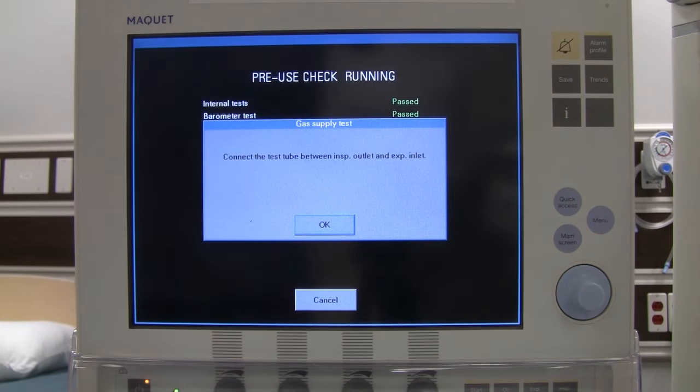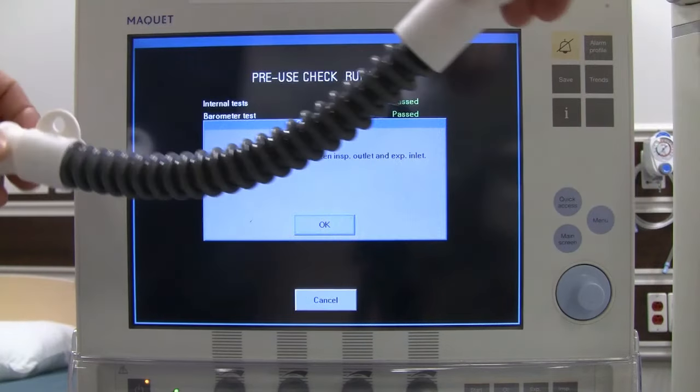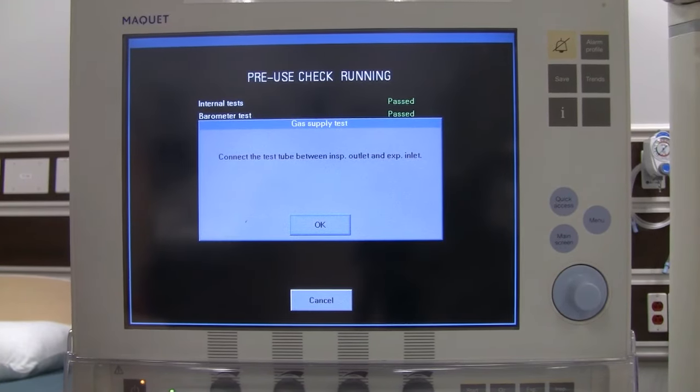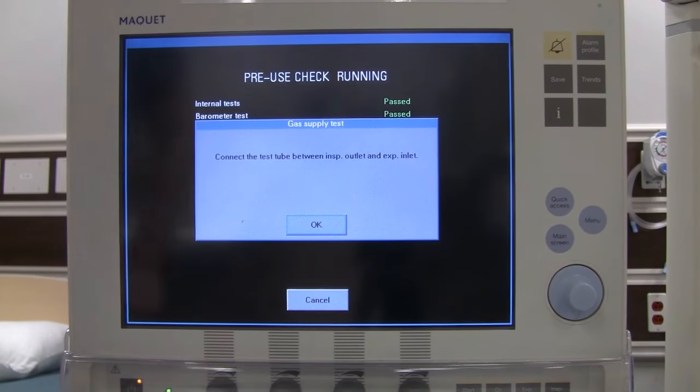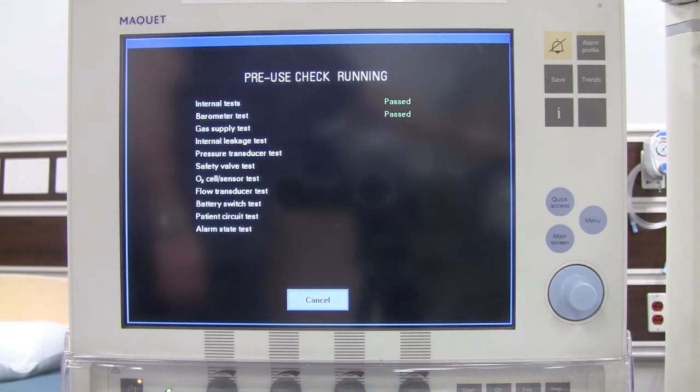The test tube is a small tube made specifically for this ventilator. Connect it between the inspiratory and expiratory outlets, then say OK and let it run its check. While waiting, note that the Servo-i is suitable for invasive and non-invasive ventilation of adult, pediatric, and neonatal patients. It can also be configured for MRI with the proper setup.